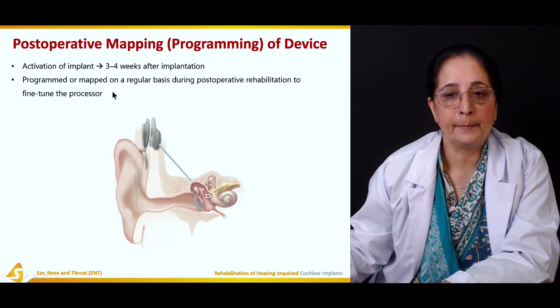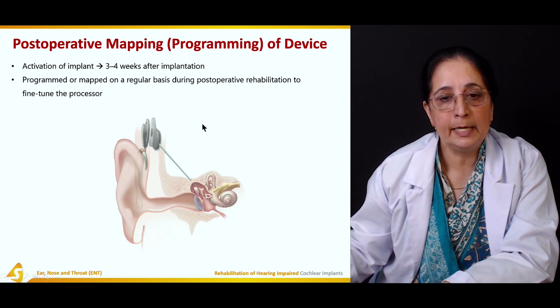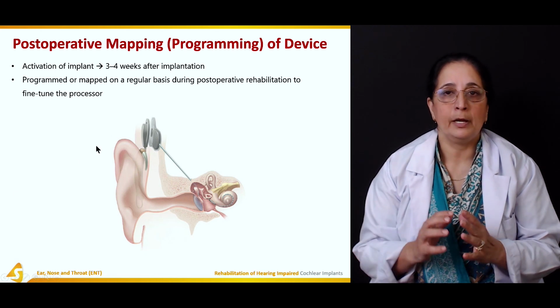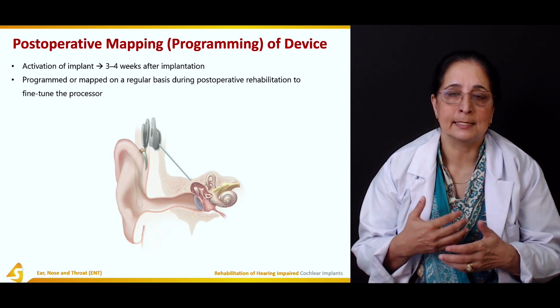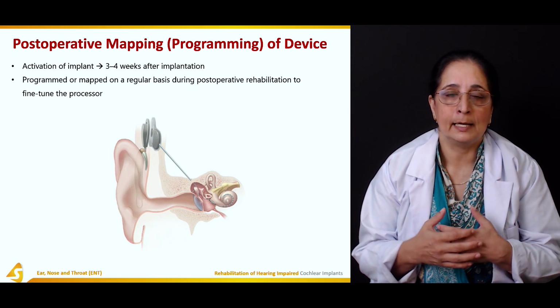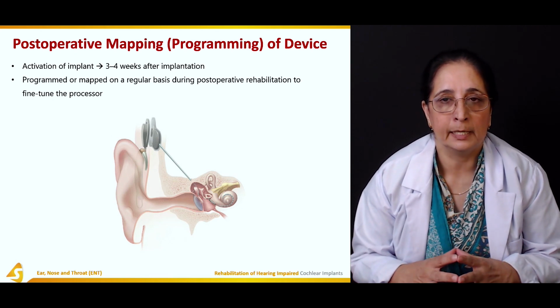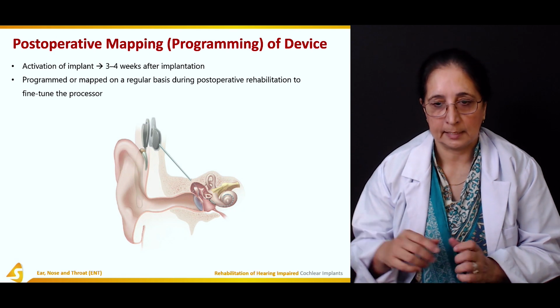It is programmed or mapped on a regular basis during post-operative rehabilitation to fine-tune the processor. So regular mapping is required after the procedure, so the patient gets acclimatized and used to the surroundings.